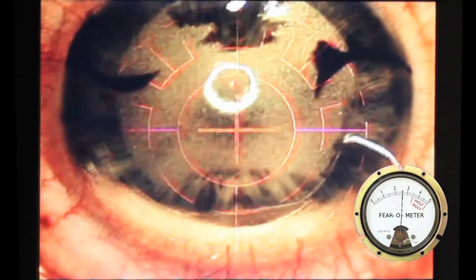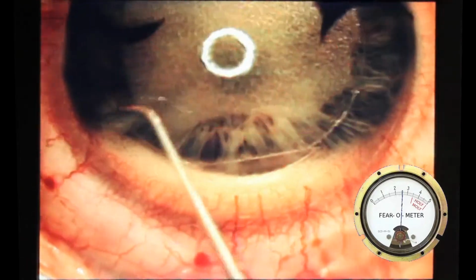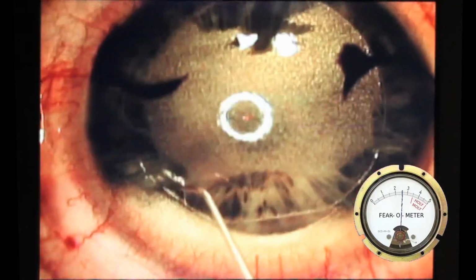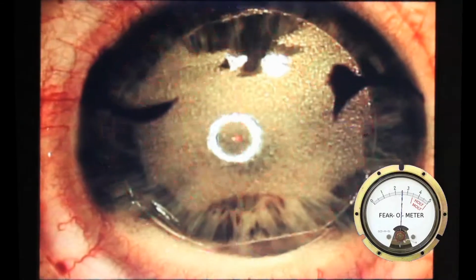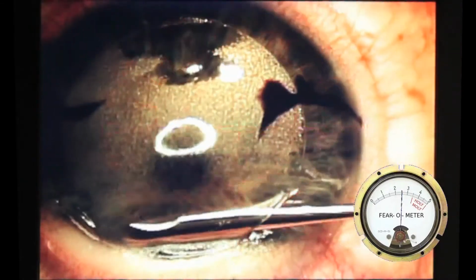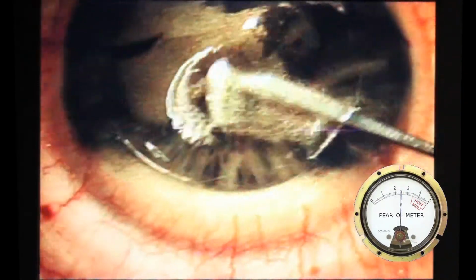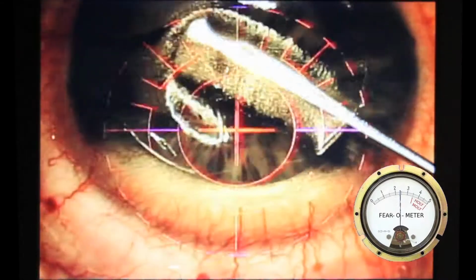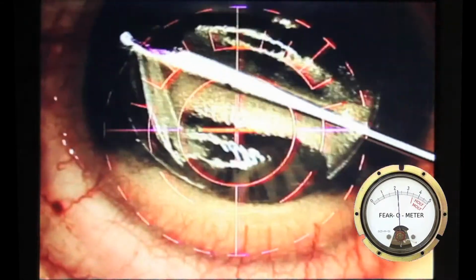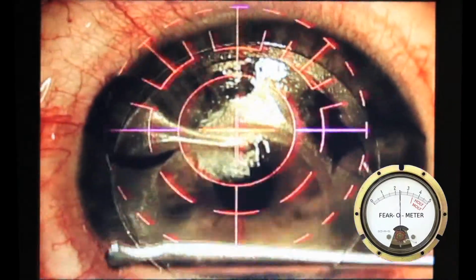So then he gets up under there with this little shepherd's hook looking thing, and he pulls the flap back, and this is, man, this is the part where you're really glad that your doctor's not an alcoholic or has the jitters or anything like that. So anyway, he pulls the flap back ever so gently. This part is really weird. I mean, this weirds you out. I just can't describe how weird this part is.